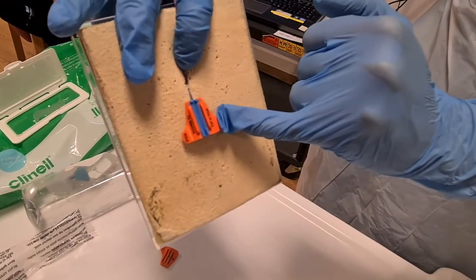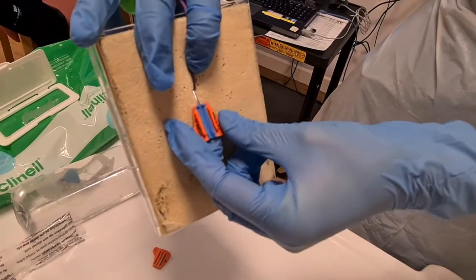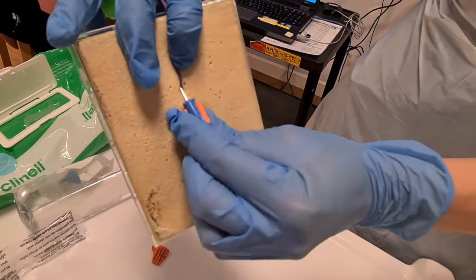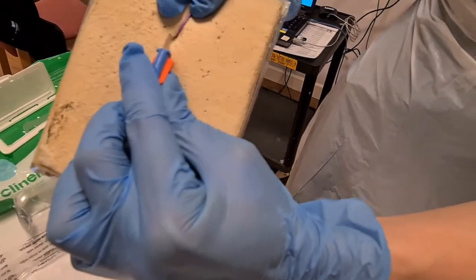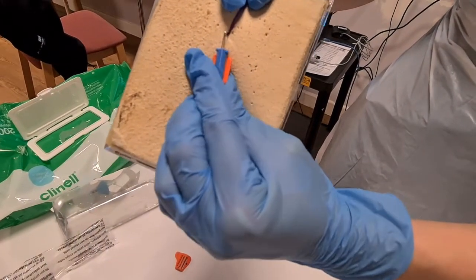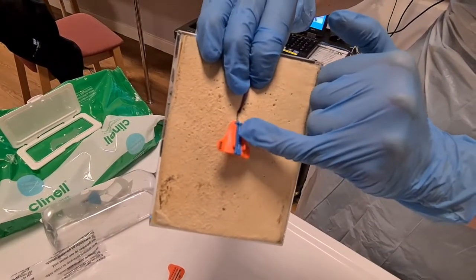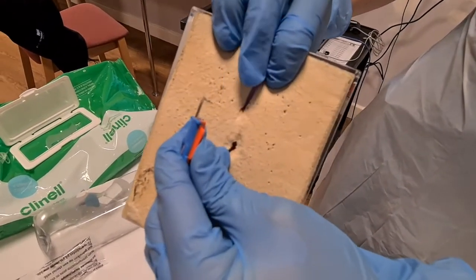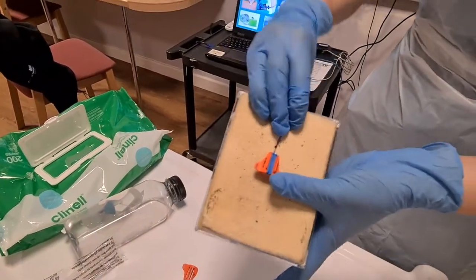There's two ways of removing this Securicath. One, you can fold it in half. That's probably the easiest method. Folding it in half, keeping it folded, otherwise it will just ping back open. Keep it folded, move the Securicath to the centre of the PICC line, and then what you want to do is push it down and then up. So down into the patient's skin just that little bit and then up. The other way is you would cut along the blue and do it individually, just as long as you are in this position, and that way it'd be easier. And that is it. That is how you remove a Securicath.